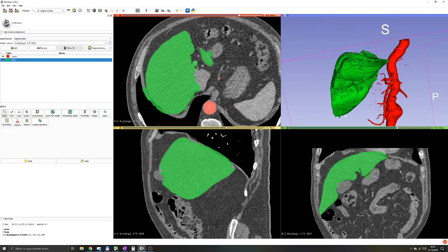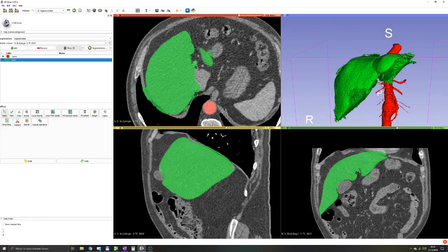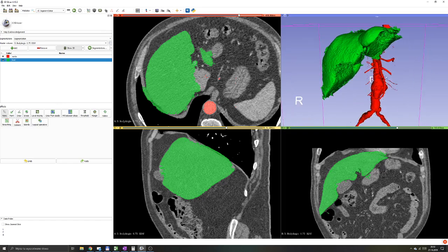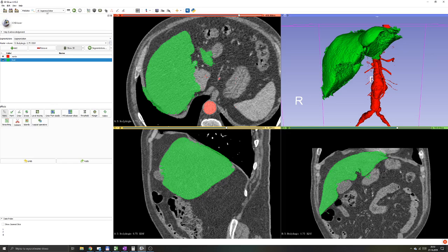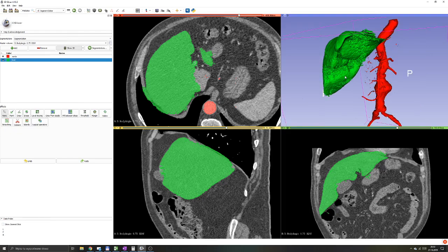Again, in your segment editor module, you have the smoothing icon. I'm going to aim to smooth the liver. Once you click on smoothing, you'll get a few methods to choose from.